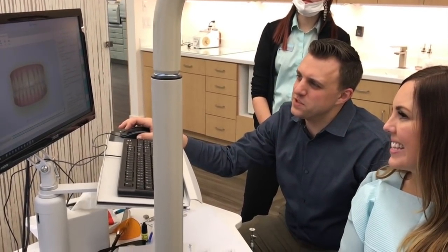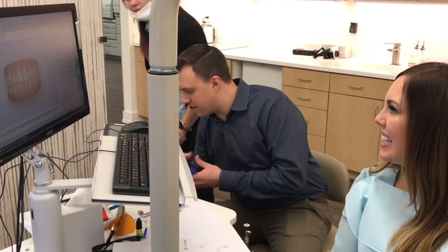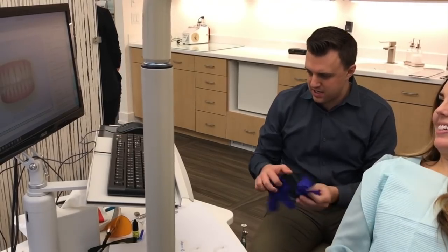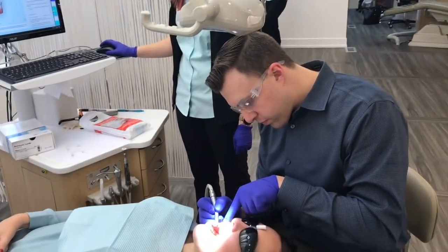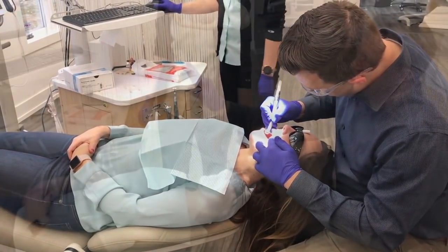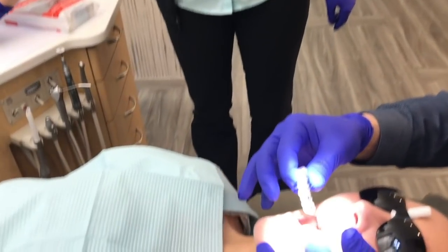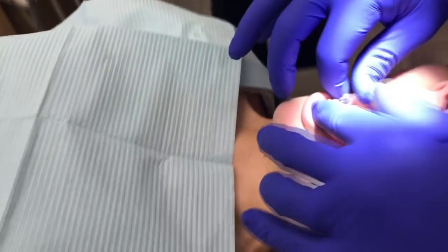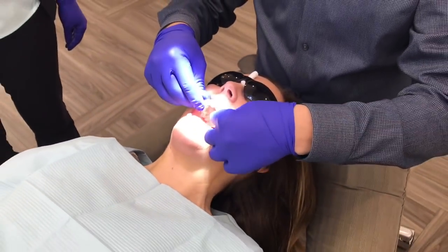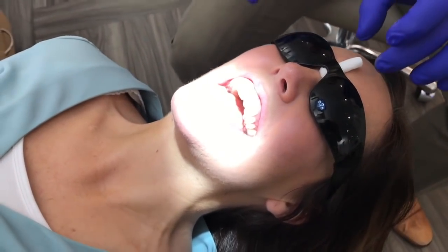So I'm going to go through now and just make sure there's no excess on your teeth, and if we need to polish it off we'll send you back. So there's the aligner. I'm going to put it in — you've got to put it in from here. All right, it's the new you! You're official.